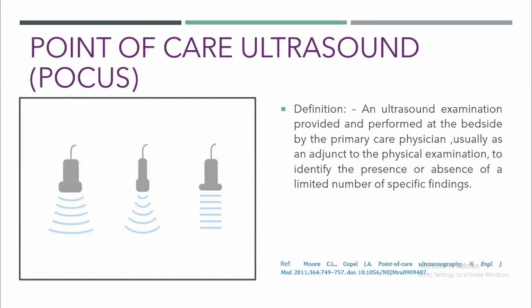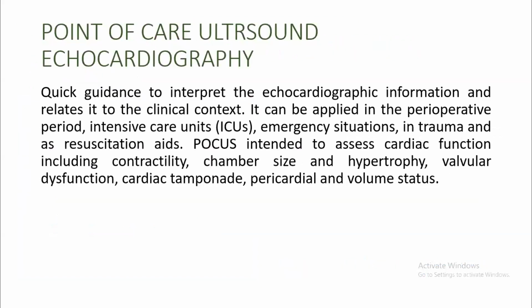Point-of-care ultrasound, by definition, is an ultrasound examination provided and performed at the bedside by the primary care physician, intensivist, emergency department physician, or anesthesiologist, usually as an adjunct to the physical examination to identify the presence or absence of a limited number of specific findings. So it is non-invasive, it is a rapid test, and it answers a specific question, what you are searching for. It goes with the clinical context, or the clinical picture of the patient.